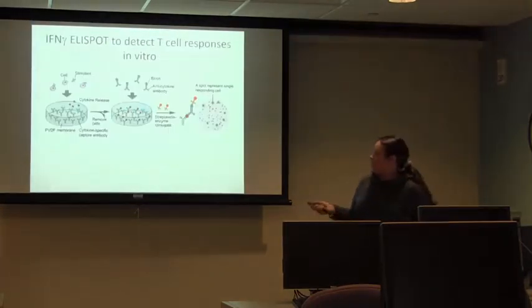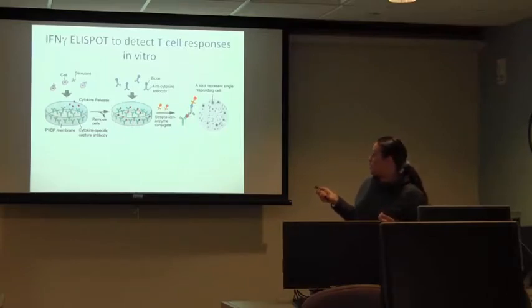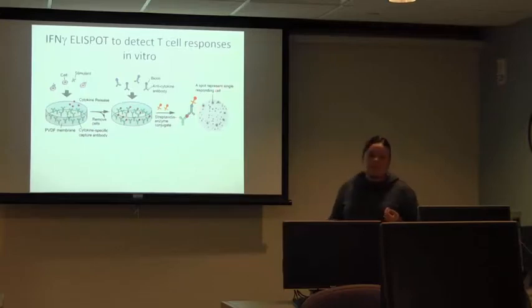And so this again, I just wanted to show you the differences between the antibody versus the cytokine, which is that we're looking at the cytokine released by the cells that are stimulated either by a dendritic cell or by CD3 or CD28 beads. And again, you use the same streptavidin enzyme conjugate, and you can see a spot generated for every single cell that is producing interferon gamma.